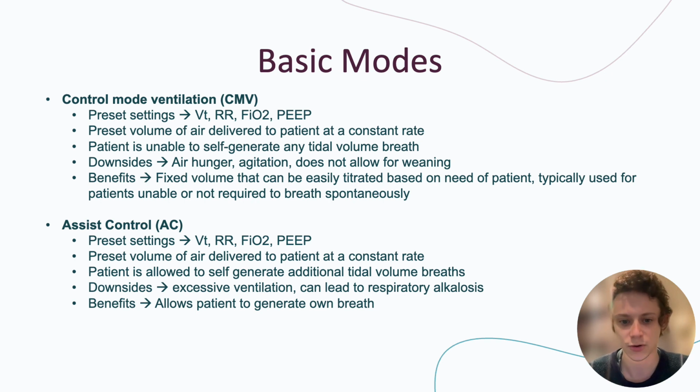Next is assist control. It has the exact same preset settings as CMV, so your tidal volume, your respiration rate, your FiO2, your PEEP. And once again, just like CMV, there is a preset volume of air delivered to the patient at a constant rate. However, this time, the patient is allowed to self-generate additional tidal volume breaths. Each breath that the patient tries to self-generate, the full tidal volume of air will be delivered to the patient. So you can think of it as a patient-triggered breath that is ventilator controlled, if that makes sense.